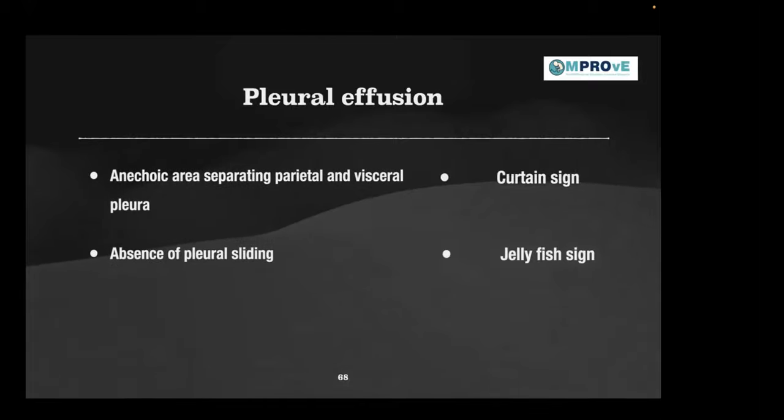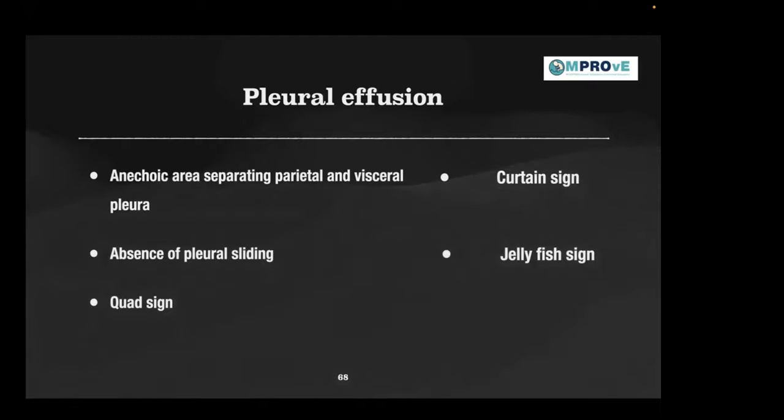Right, pleural effusion again is indicative, not always, but most of the time, of a pneumonic process. And sometimes you can have pleural effusion because of hemorrhage or malaligned long lines with PN in the pleural space. So how do we get to know, and what are the signs?